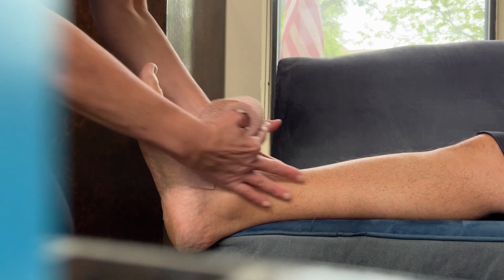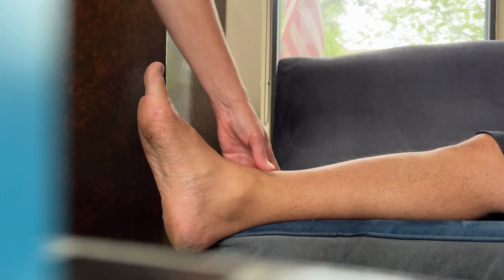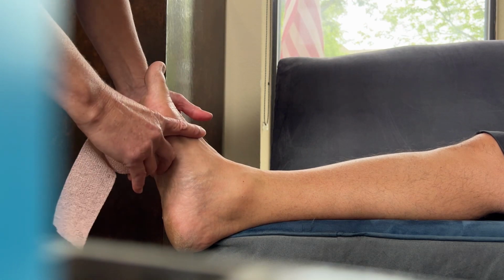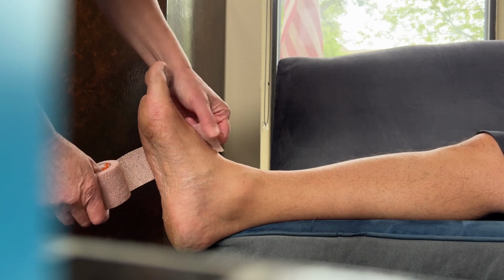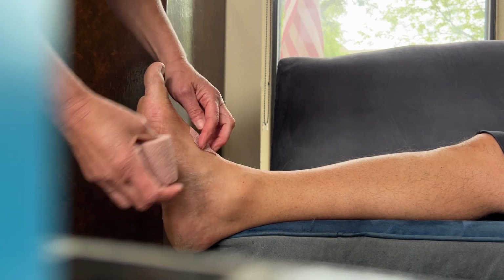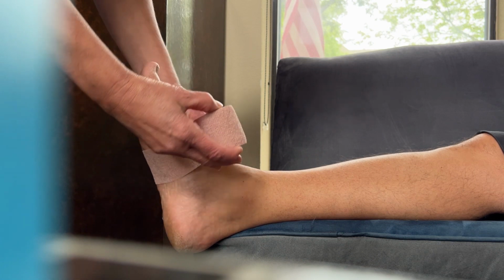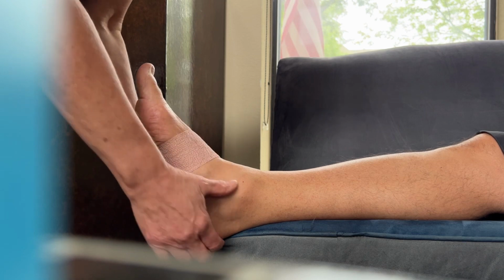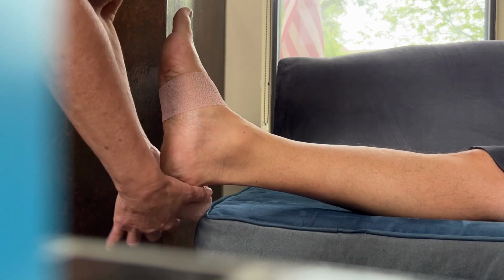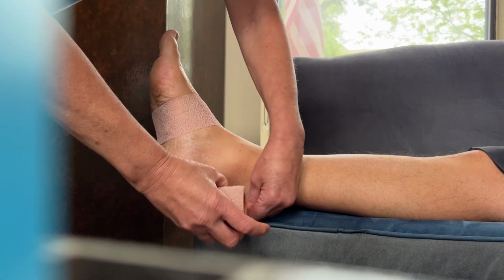I want to push the fluid up. I want the lymphatics to go up. I want to control swelling, and I'm going to start at the foot. A lot of times swelling will come down. You never want to go in a circumferential pattern, round and round. You always want to do a kind of a V pattern or a figure 8. That way you don't get stasis of the blood vessels, and you don't compress them and cause any constriction.